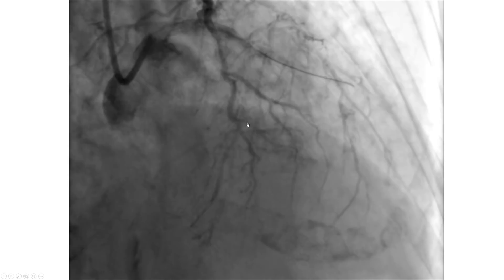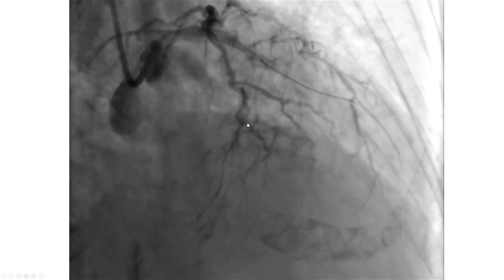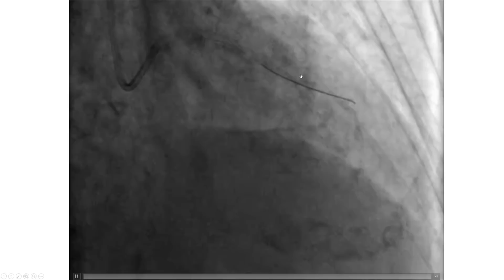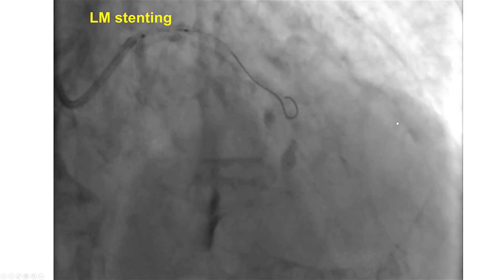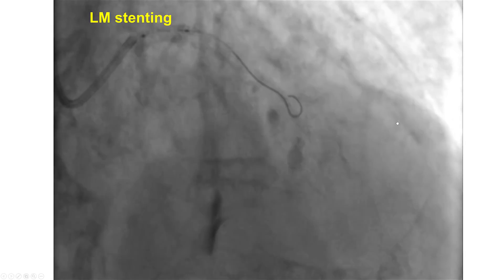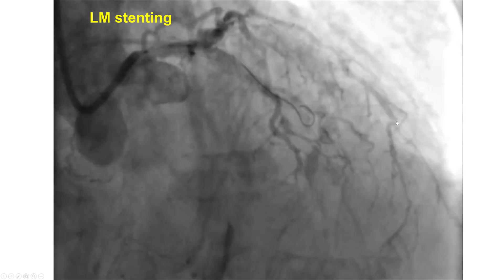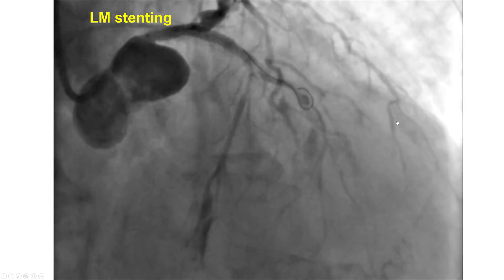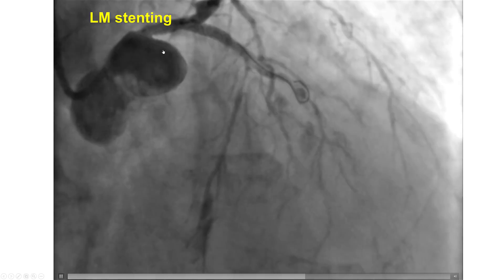Unfortunately, during attempts to cross the lesion, which was very challenging, there was acute vessel closure. We lost flow all the way to the distal LAD as well as the diagonal branch. At this point the patient started becoming hypotensive. During attempts to advance another wire and regain access in the distal lumen, there was a dissection of the left main which was treated with a stent.